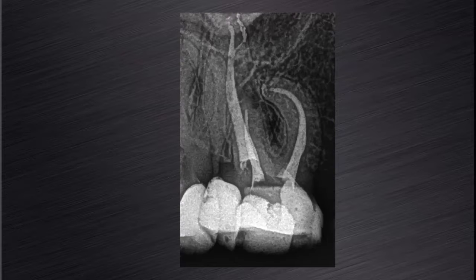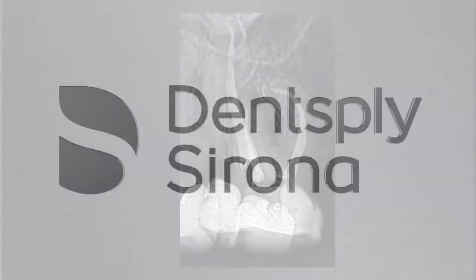This is the post-operative radiograph that illustrates the immediate post-operative result, clearly showing maintenance of the root canal anatomy in the mesiobuccal root canal system using this protocol that I've just described.